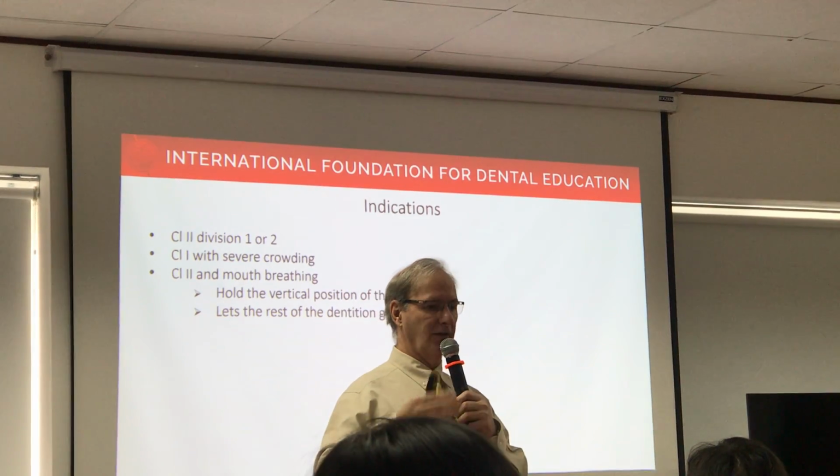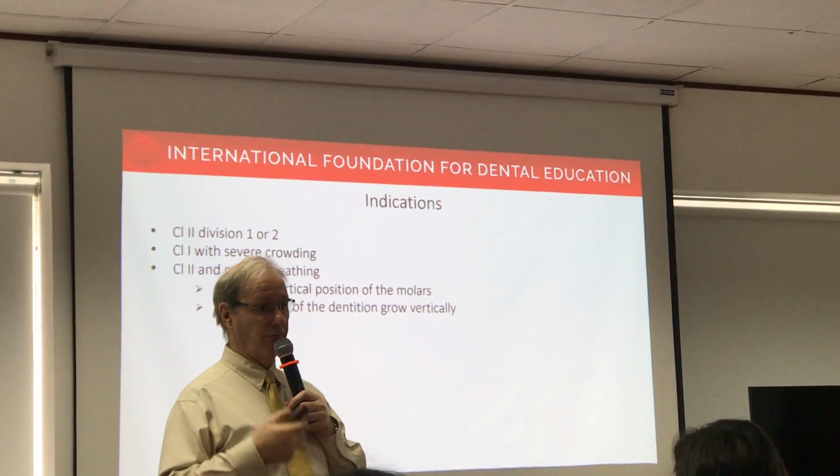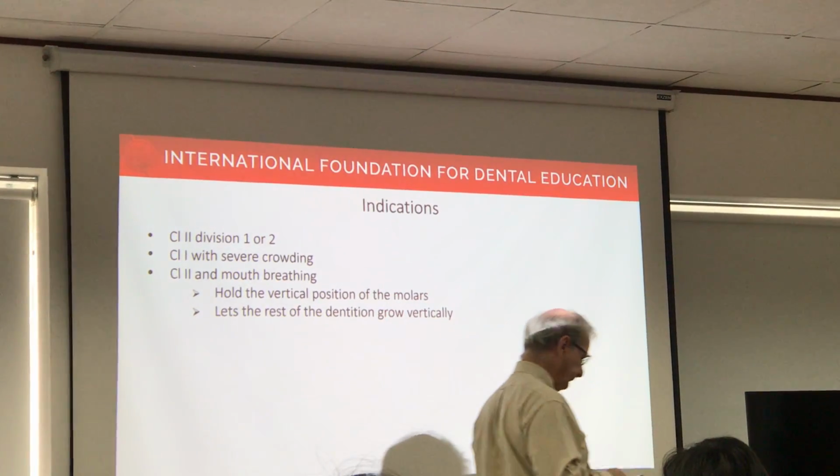So they have a lot of class 2 open bites. And they are very good kids, and they will wear the headgear as well. Very good result.